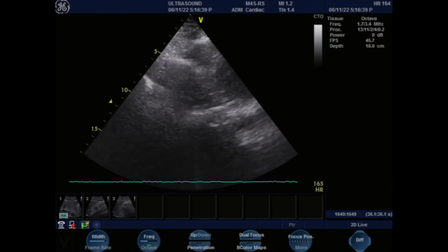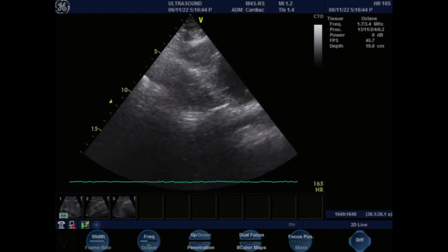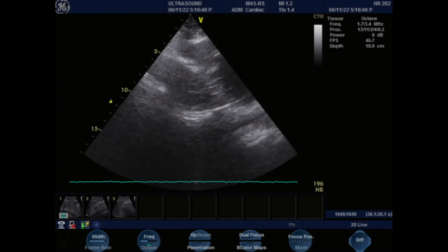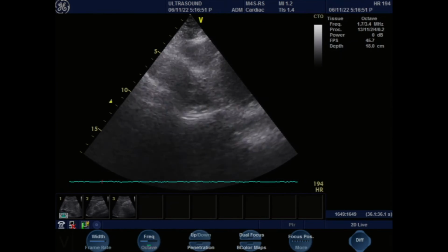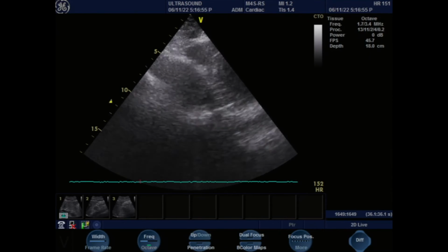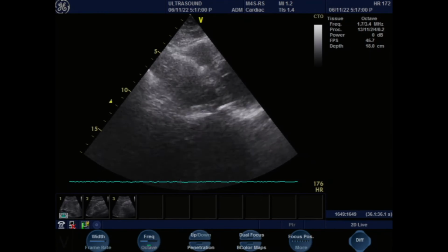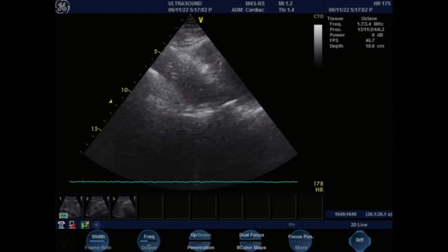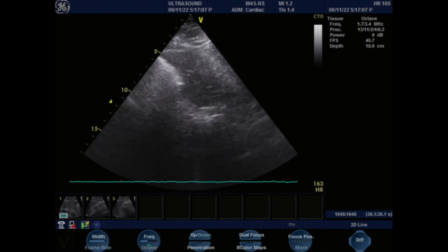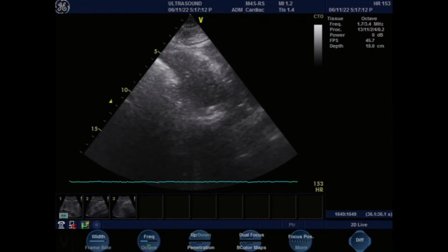chambers. Now you're further down. You're seeing the apex of the heart, and you can see the two chambers. Because the common misconception is that the heart is like this. Okay? The heart is actually not straight down. The heart is sideways. That's one. Plus, there's another thing too. It is rotated inwards. So what you find is the left ventricle in the back, the right ventricle in the front. So that's why in that probe, in the first view, the first thing you see is the right ventricle. Pay attention to the ventricular septum definition.